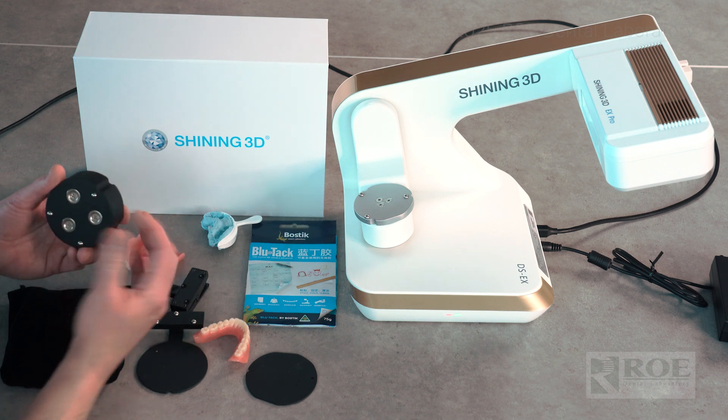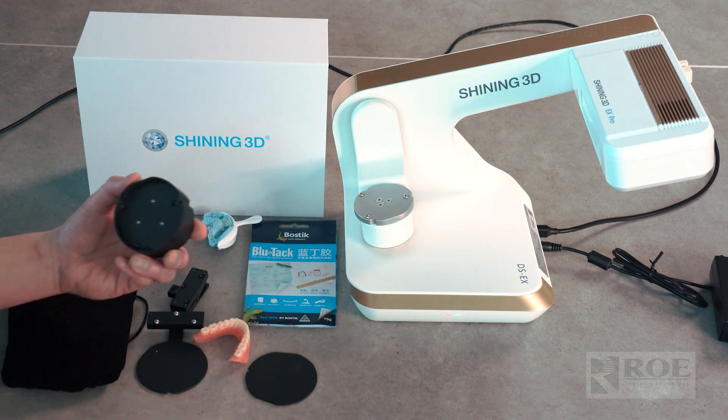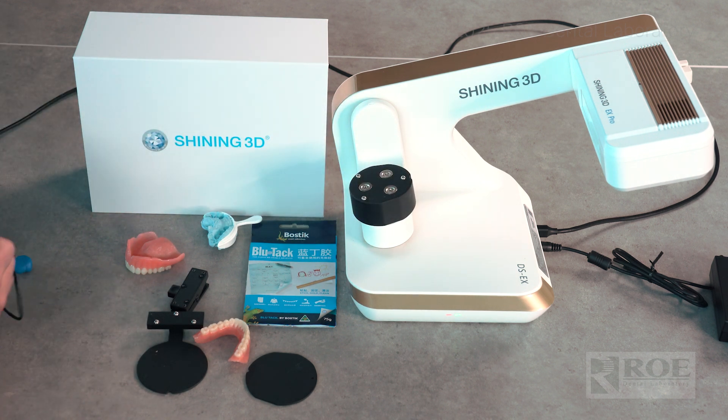You'll see the elevating plate has a notch — the notch goes right here. You want to make sure they line up; it should snap on like that.